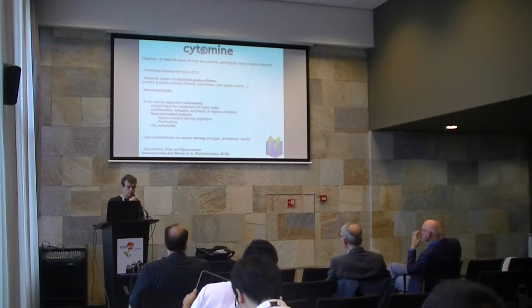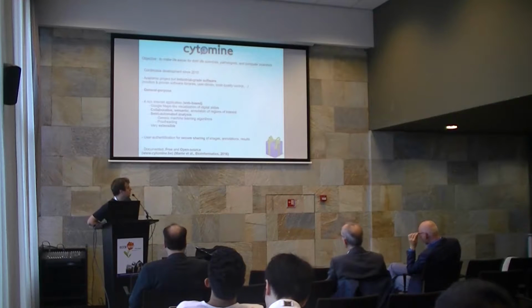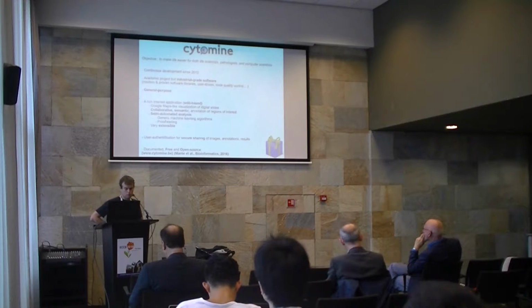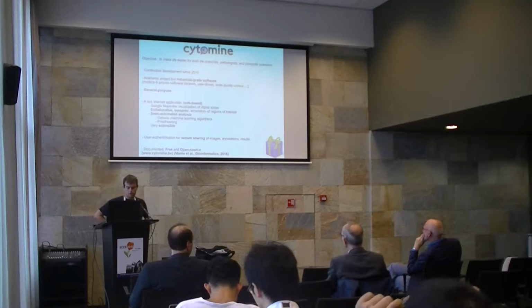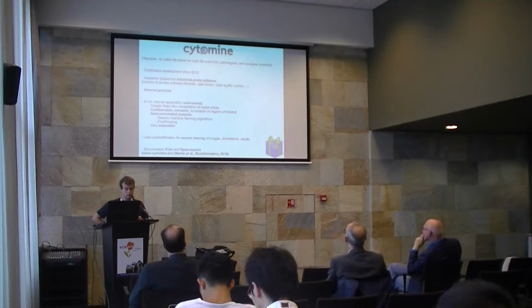We also implement secure protocols to share images, annotations, and results with your colleagues. And very importantly, it's open source software, so that means that everything is accessible. You can understand deeply what the software is doing, and you can extend it.